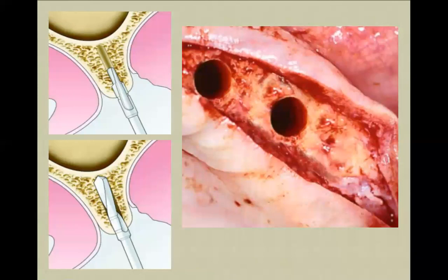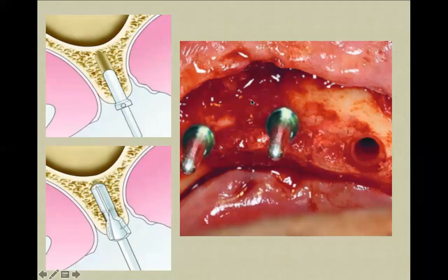And once you obtain this system, once you obtain these implants, you will also be provided with the surgical protocol in written, electronic, or maybe video form. Okay. So you did the holes, you created holes. Yeah. It looks like this. Yeah. Good. You can use parallel pins on the opposite side to be sure that everything is parallel.